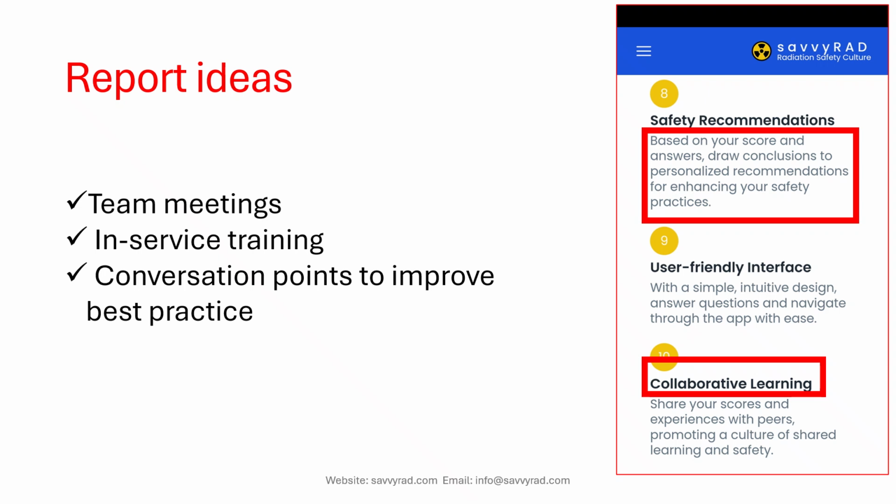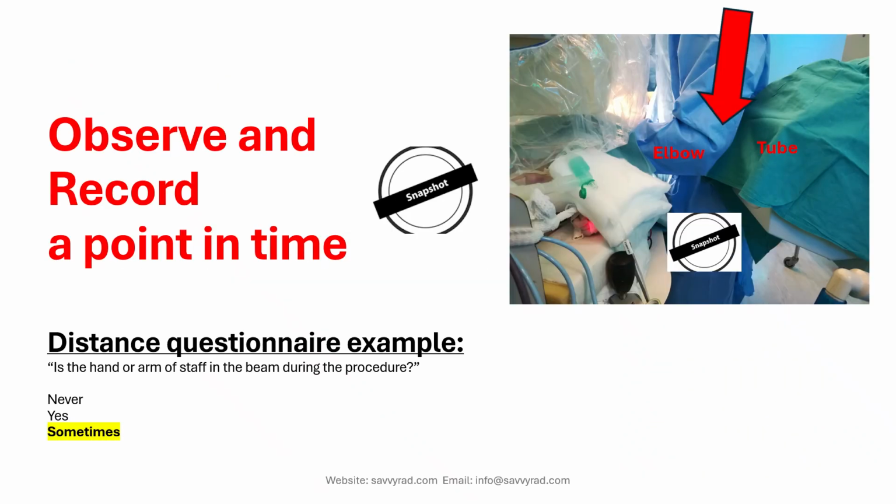So the idea of the report is to have safety recommendations specifically tailored for your own site and collaborative learning so that you have conversation points how to improve your best practice. The idea of savvyRAD is to observe and record a point in time, a snapshot, not to assume things.